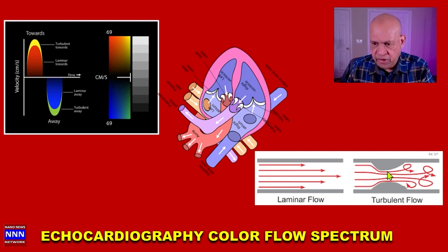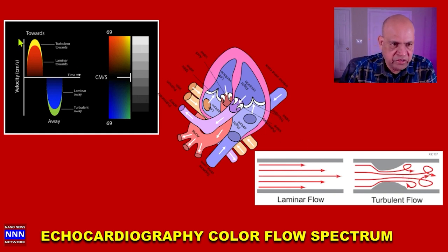However, if you have aortic stenosis with narrowing of the aortic valve, the jet going through here increases in velocity, and when it goes past the stenosis, the lumen widens again, so it has more space to disperse, creating these circles. These circles are represented by these two extremes, the yellow and the green or cyan colors, creating a mosaic pattern which represents the turbulence.